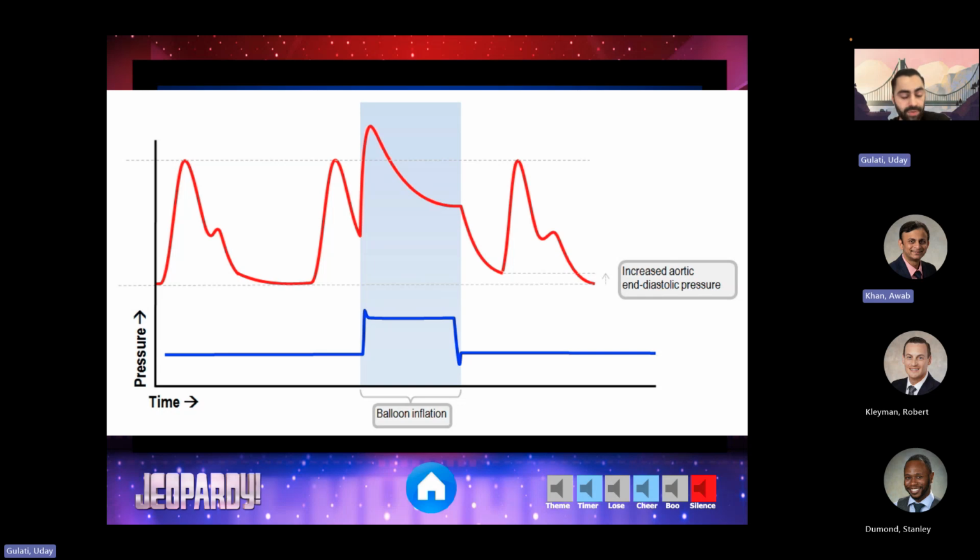The reason why delayed inflation is also clinically important is that a very common reason for it to be delayed is a kink in the catheter. It's like an electrical or pressure trigger, where theoretically you shouldn't be able to mess it up. I'm sure you can find a way, but theoretically you shouldn't be able to.